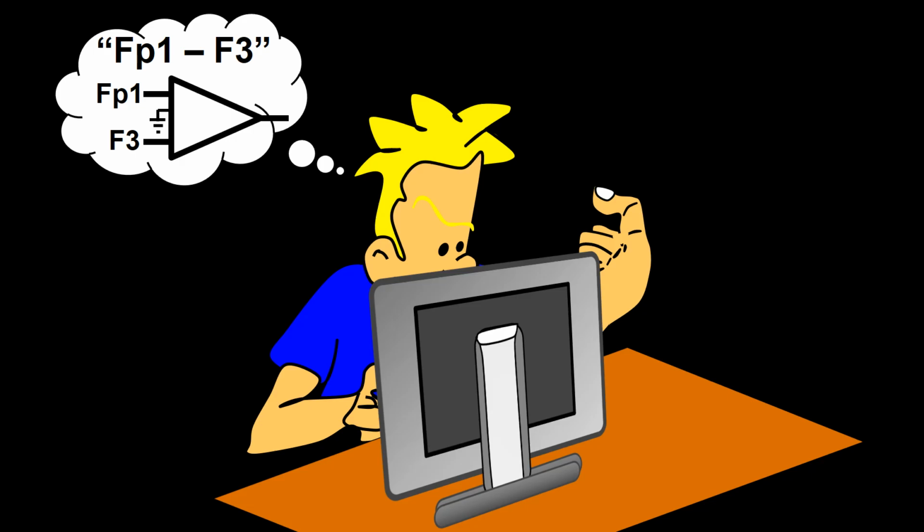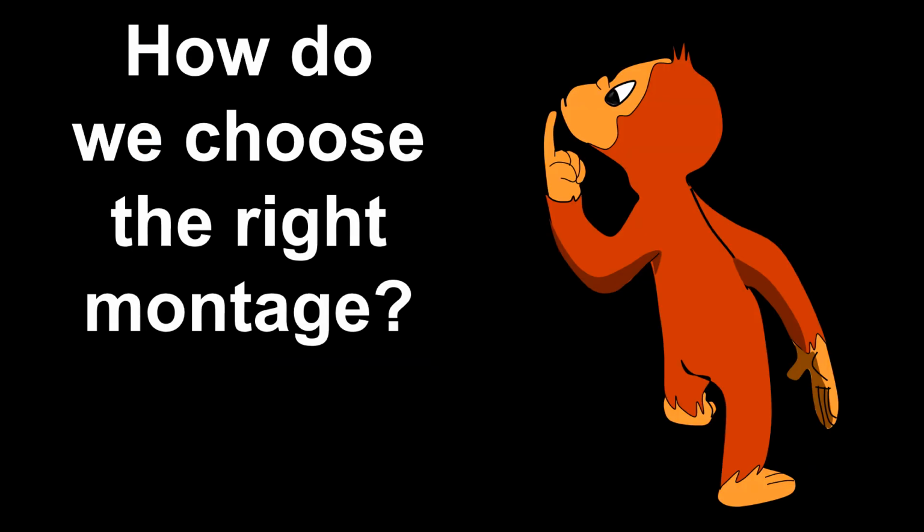It is for this reason that for the rest of this talk, I will talk about each channel in the classical sense as being the product of direct comparison between the electrodes being analyzed. So the age-old question regarding EEG interpretation, which montage to use to record an EEG, has changed to which montage to use when reviewing an EEG.